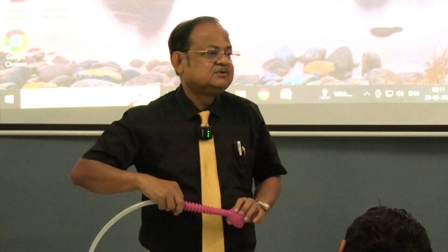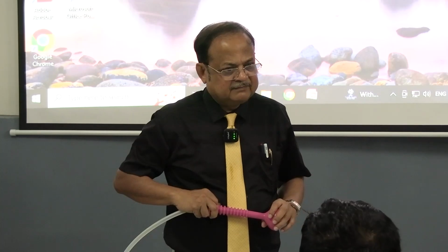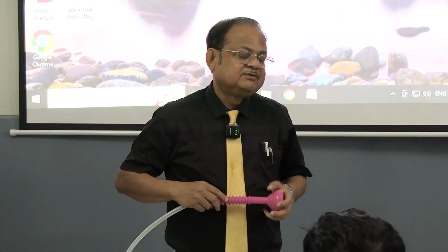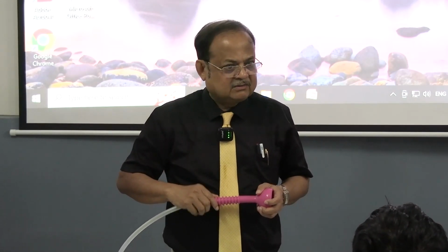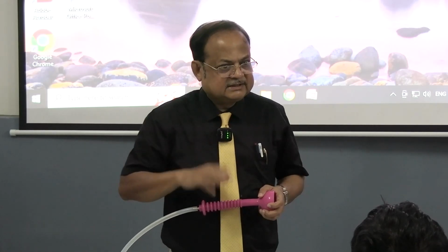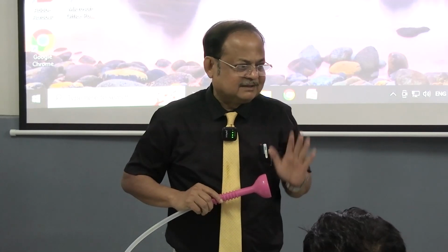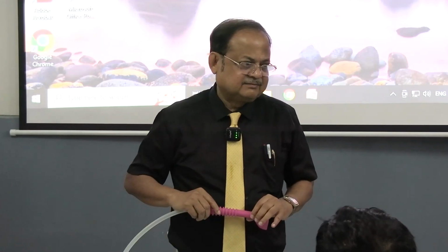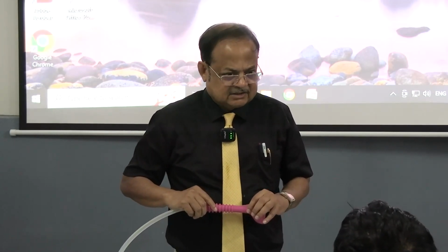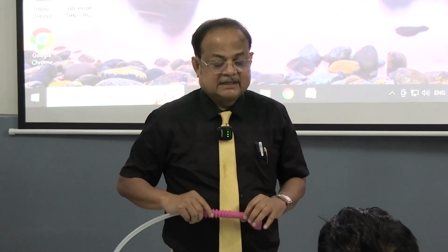ইউজুয়ালি 3 to 4 ট্র্যাকশনস আর নিডেড। ফেলিওর বলা হয় যদি 30 মিনিটের মধ্যে না হয়। তখন আমরা অ্যাসেস করি যে আদৌ ভ্যাজাইনাল ডেলিভারি করা যাবে কিনা। যদি না যায়, ডাইরেক্ট সিজারিয়ান সেকশন, দ্যাট ইজ অলসো ডিফিকাল্ট সিজারিয়ান সেকশন, বিকজ হেড ইজ লো ডাউন অ্যান্ড সেকেন্ড স্টেজ, বাট ইউ উইল হ্যাভ টু সেভ বোথ দ্য মাদার অ্যান্ড বেবি ফার্স্ট। বাট যদি দেখা যায় you can apply the forceps delivery, you can apply with the help of the forceps, that is a sequential instrument. But the sequential instrument use is not encouraged nowadays.